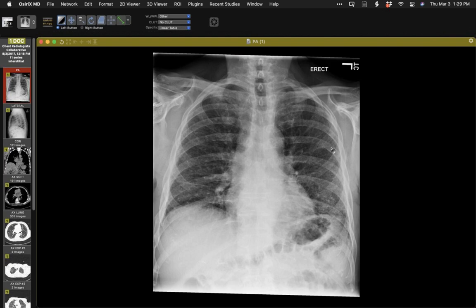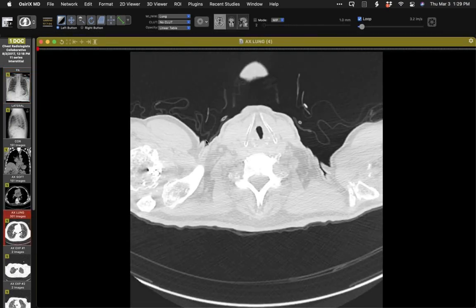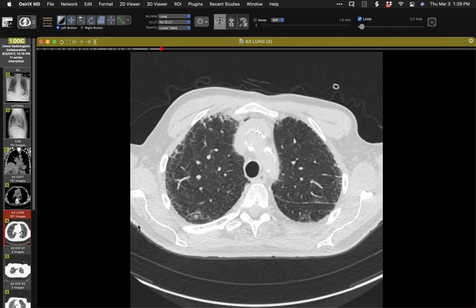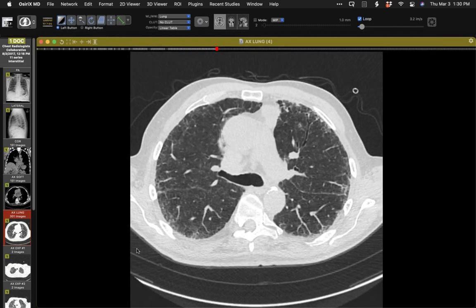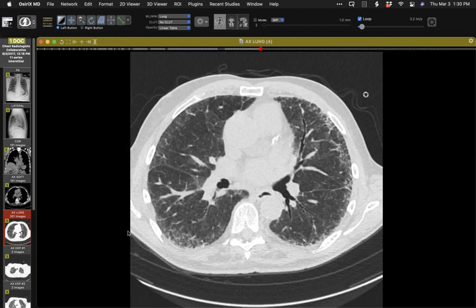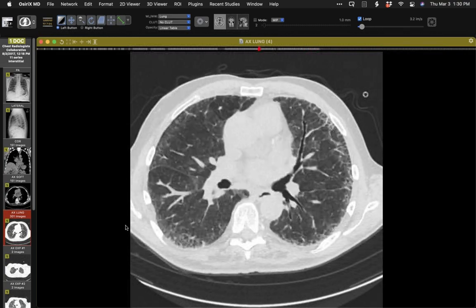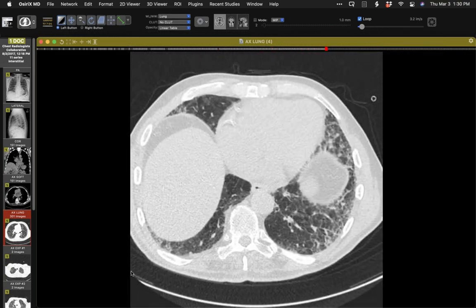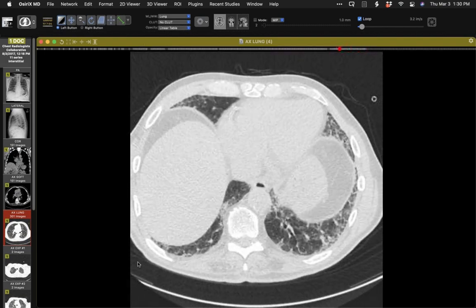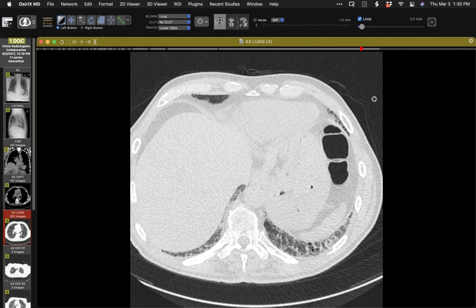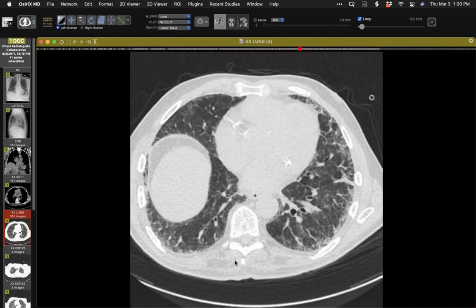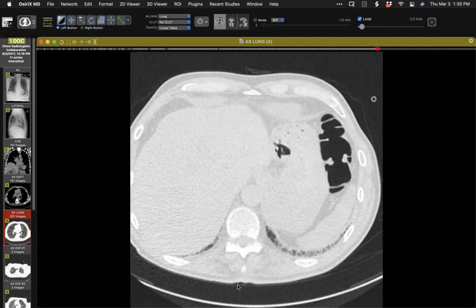Imaging findings on radiography: reticular nodular opacities in the peripheral lungs, predominantly at the bases. CT shows a lot of subpleural reticulation. Upper lung zones are involved, but I don't think the interior of these lungs is normal — so it's not exclusively subpleural, but definitely predominantly subpleural. There is a greater degree of involvement of the lower lungs. The only hint of subpleural traction bronchiolectasis is just there, but otherwise remarkably absent.